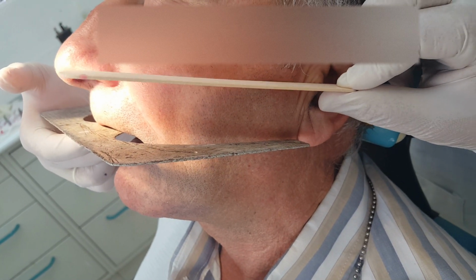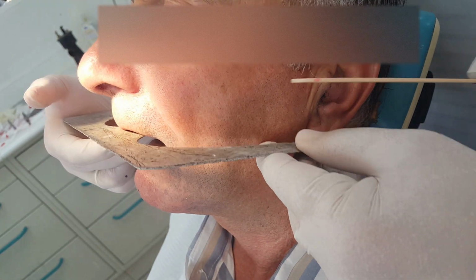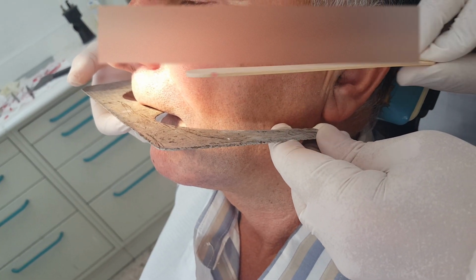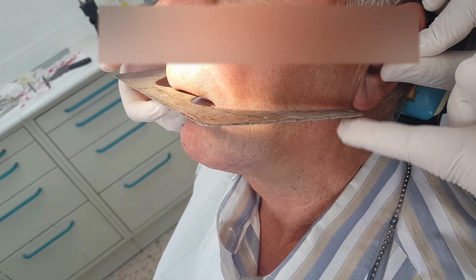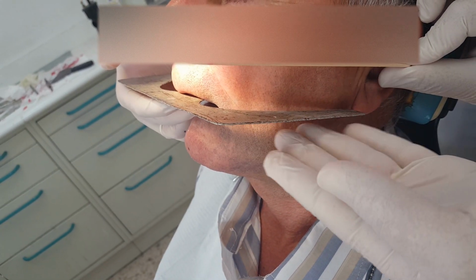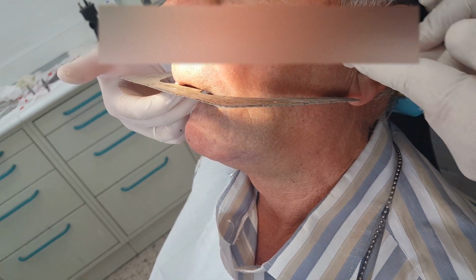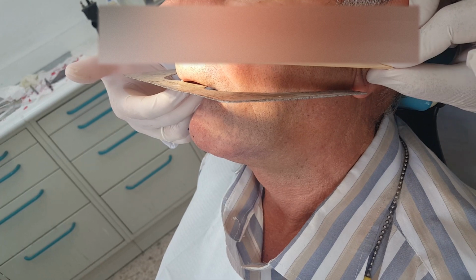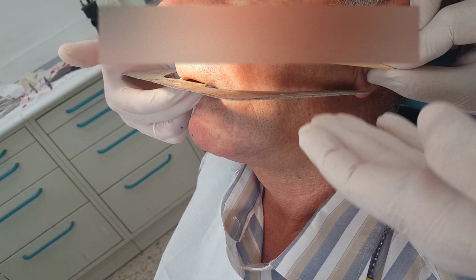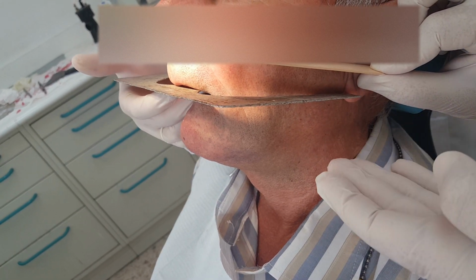But another point, what is the difference between middle and lower? Remember, what am I looking at? I'm looking at the posterior parallelism of the wax rim. So if I'm using this, that means this base plate or the wax rim level of the occlusal plane, it's higher. This is closer. That means the occlusal plane is high. When I take the parallelism with the lower tragus, what I'm actually measuring is I'm making this occlusal upper table closer and more down. When is this recommended to make the occlusal table downwards?